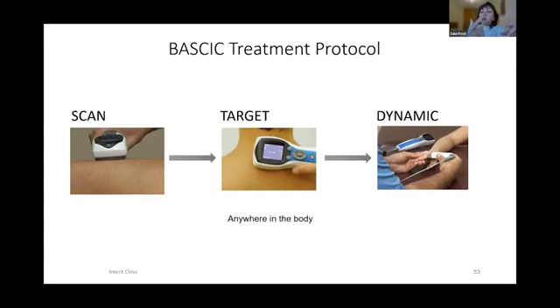And then you put on dynamic mode, so you put this oscillating frequency, and you start moving and look which way it's most restrictive, yes? And do this sweep, 4-directional sweep, until you get the sound. And then you go back to the points where you have less, yes?